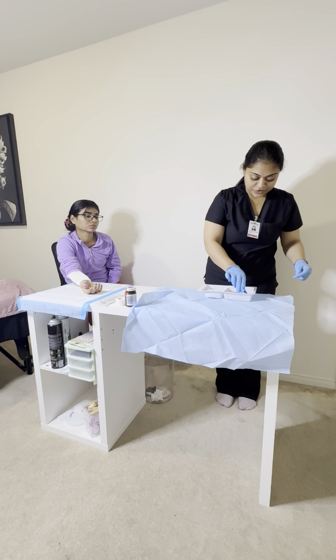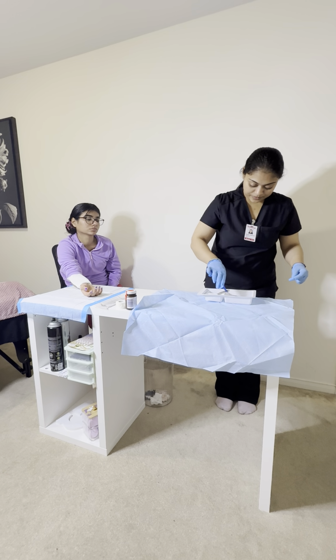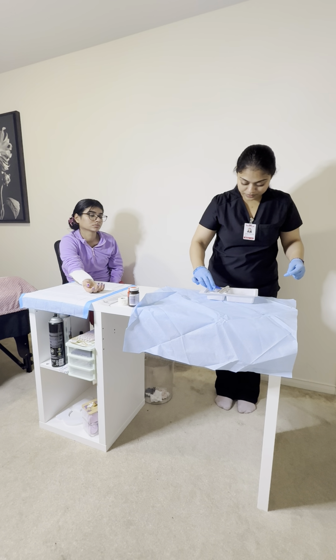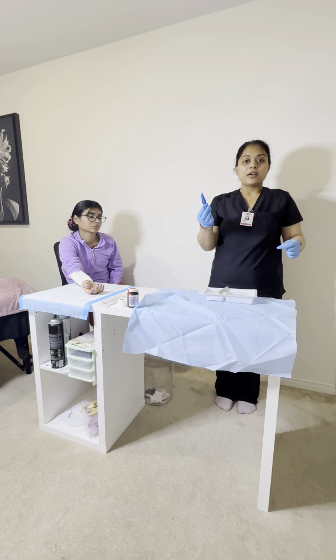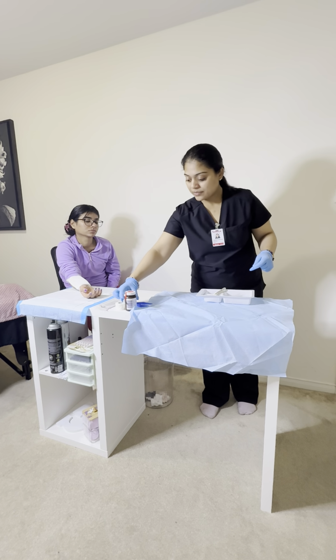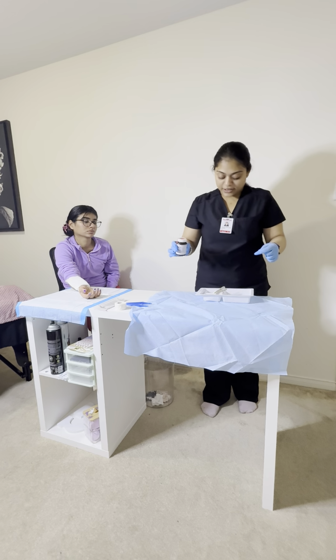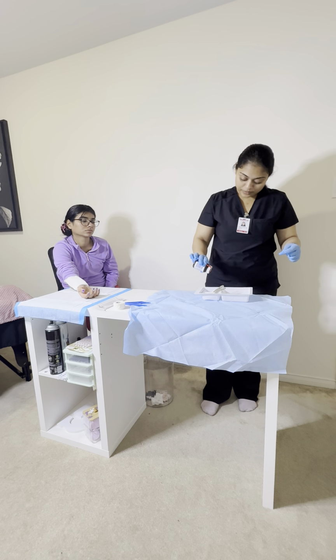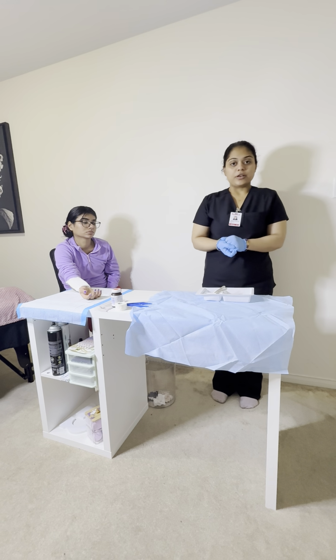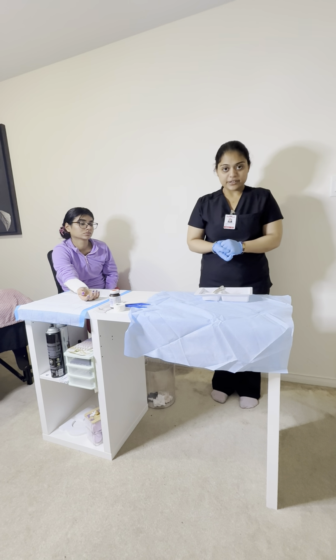Okay, so arranging the forceps. Putting this forceps at the edge. Taking the normal saline, pour it. So okay, now I have opened my sterile kit.